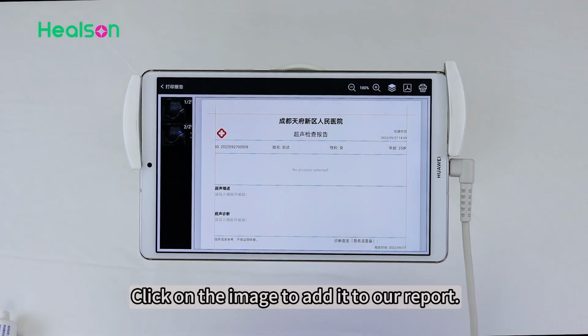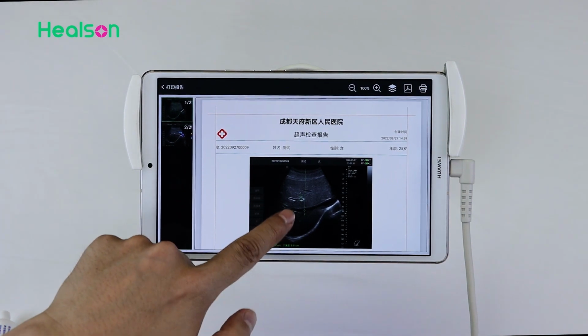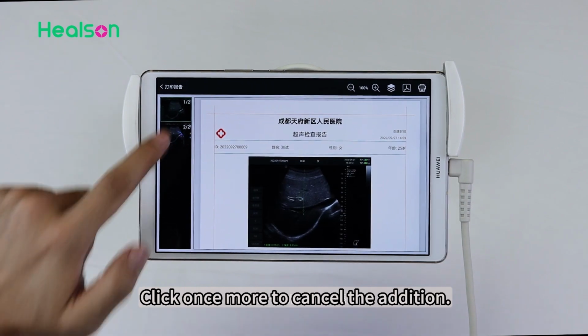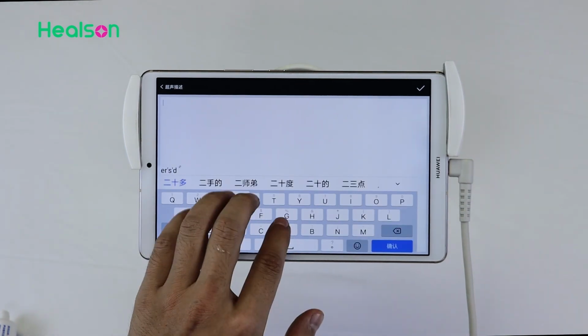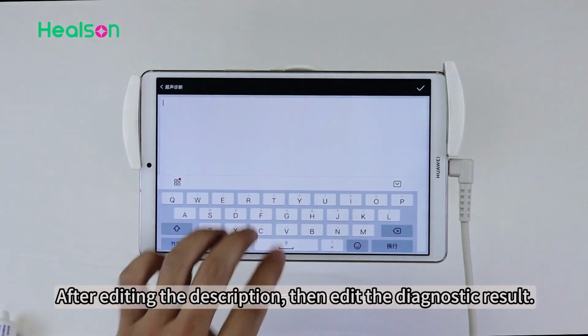Click on the image to add it to our report. Click once more to cancel the addition. Click on the ultrasound description area to edit. After editing the description, then edit the diagnostic result.